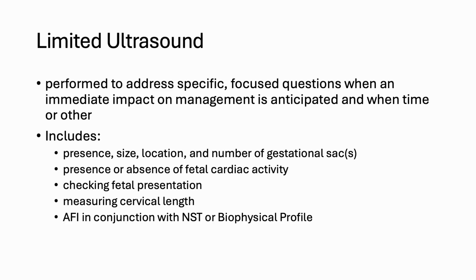We look at the presence, size, and number of gestational sacs, the presence or absence of fetal cardiac activity or the fetal heart rate, checking for presentation, measuring cervical length, like in cases of threatened preterm labor or history of preterm labor, and then AFI with the NST or doing a biophysical profile.